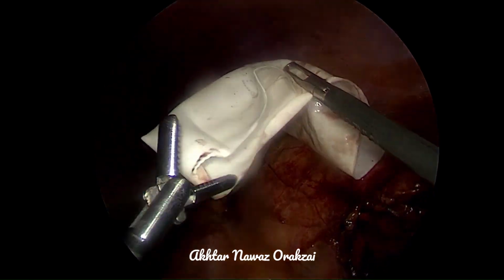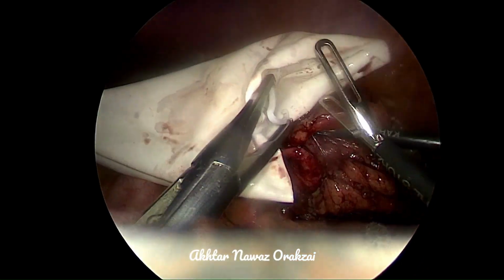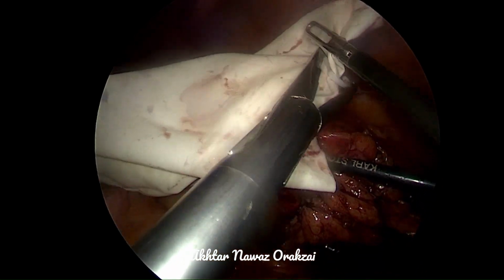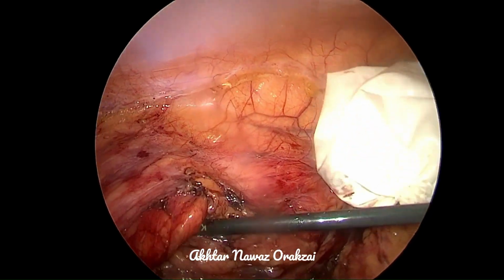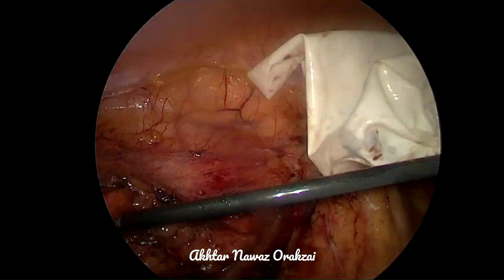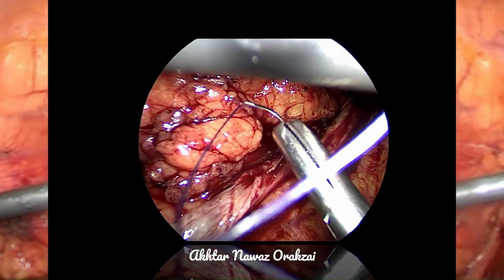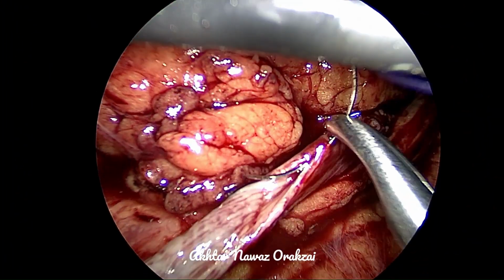So when the 5 stones are completed, we are going to close the mouth of the glove bag so that they do not drop into the peritoneal cavity, and we will place it somewhere safe and visible where we can remove them by the end of the procedure. So we start with the repair.